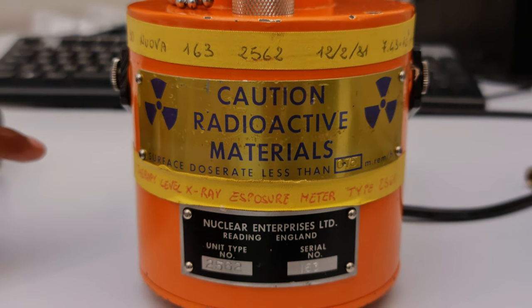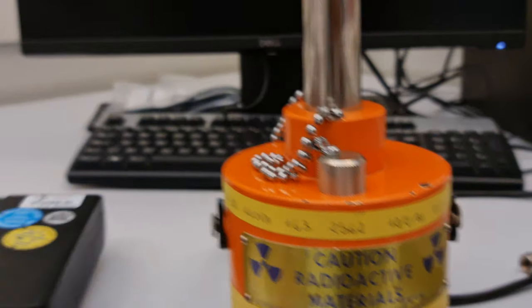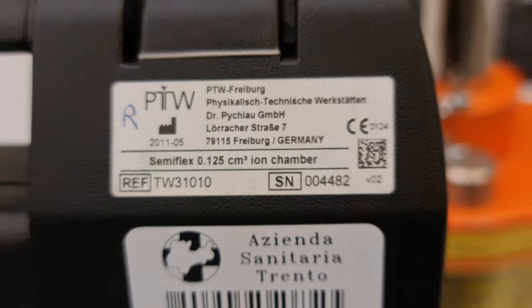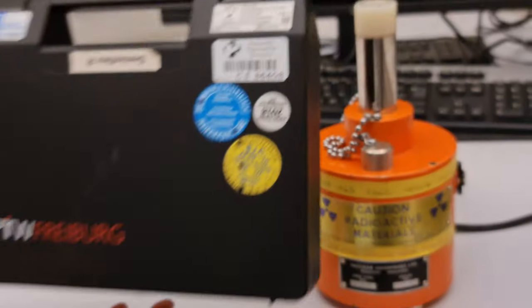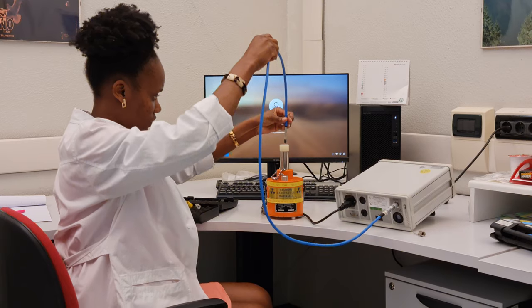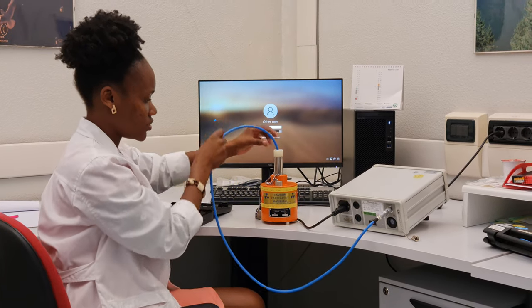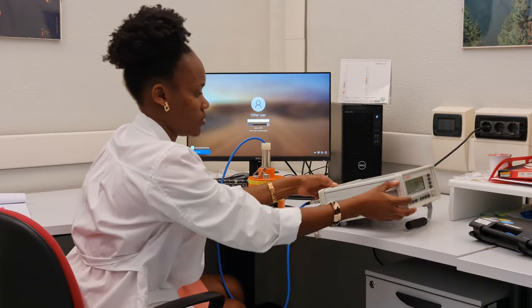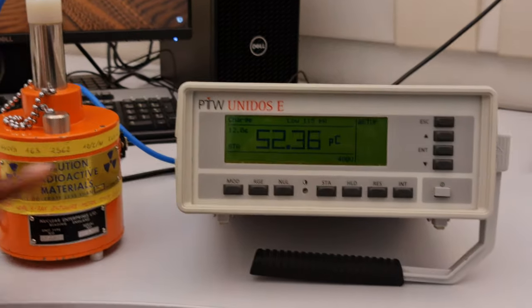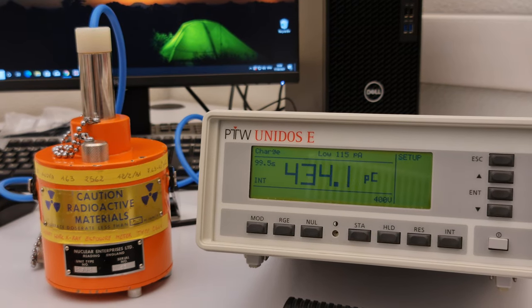The radioactive material we used was Strontium-90 to check for the stability of the detectors. The detector we used is a Semiflex, and we connected this detector to the electrometer and inserted it inside the Strontium-90 radioactive source holder to take the measurements. We took three measurements and got the average of those readings. That was it for the Semiflex.